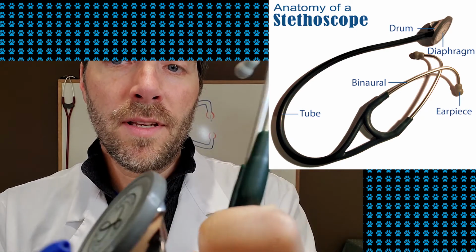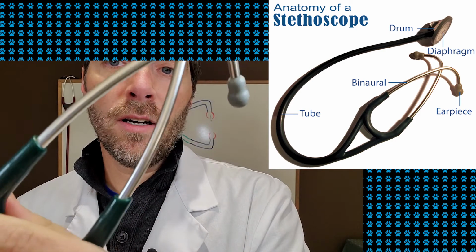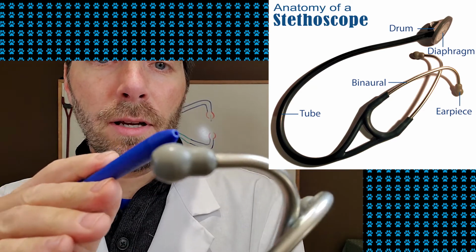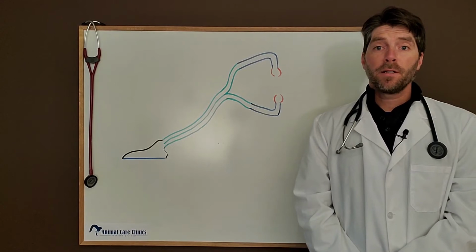So, the sound enters here by wiggling the diaphragm, and this whole contraption is just a hollow tube all the way to the end. The sound waves travel all the way down and then come right out of the earpieces there. Just a hollow tube. Like I said, really old school tech. So let's see how all these parts work together.